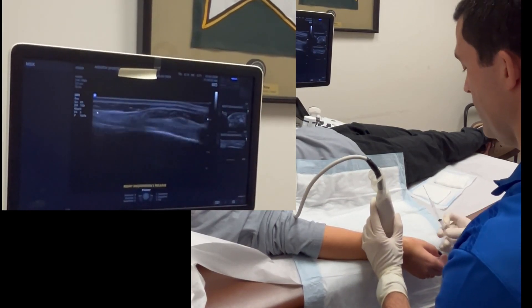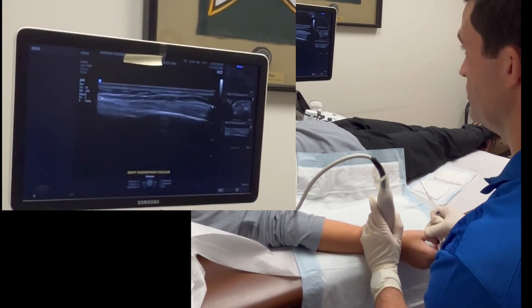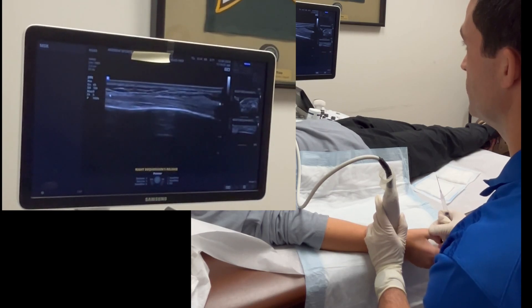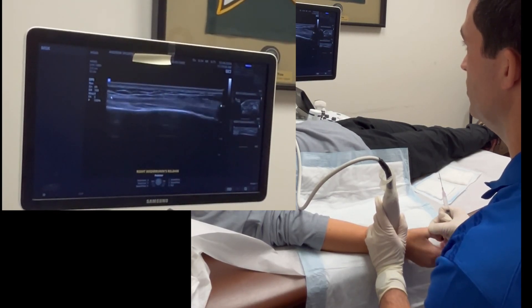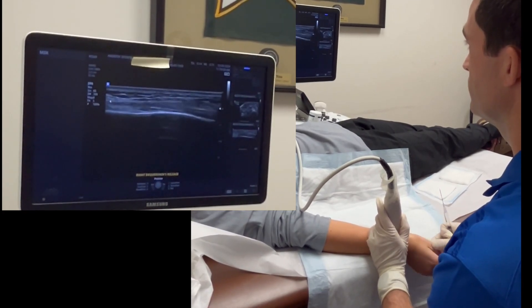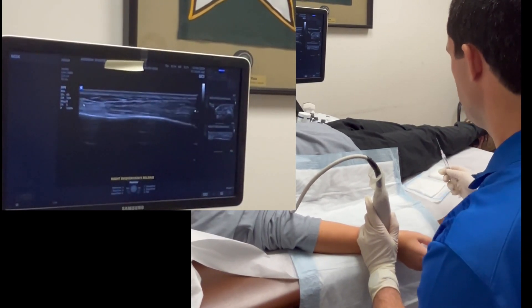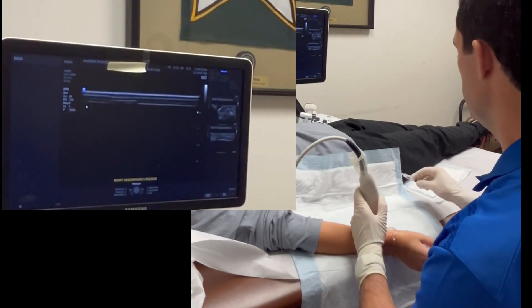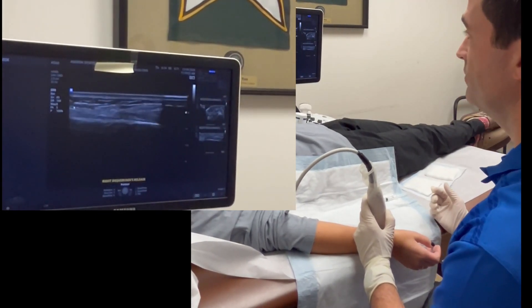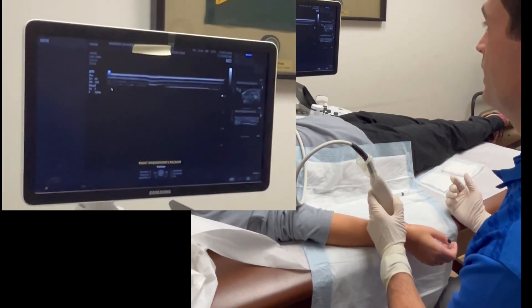We come out and I'll move the thumb into flexion and extension for a dynamic evaluation to make sure the tendon is gliding smoothly. You can see the tendon gliding smoothly — it's no longer entrapped. That completes the procedure. We'll put a regular band-aid over the area, and we'll instruct the patient to avoid heavy lifting or heavy gripping for two weeks after the procedure, after which they can resume activities as tolerated.